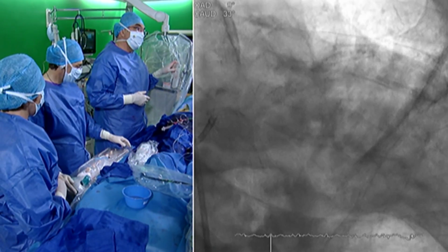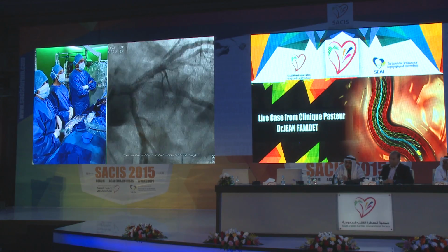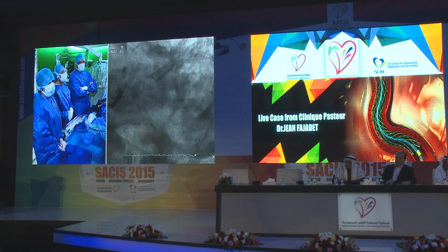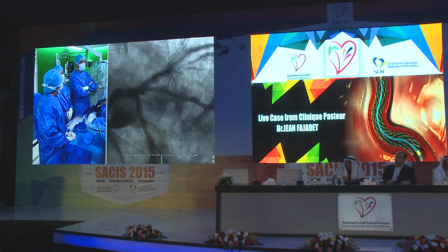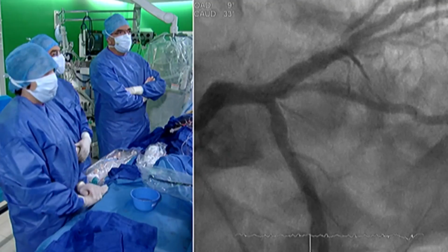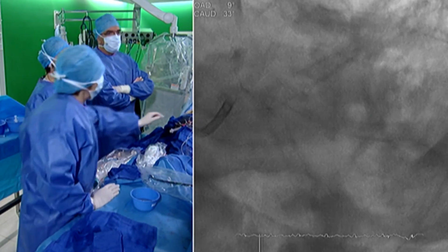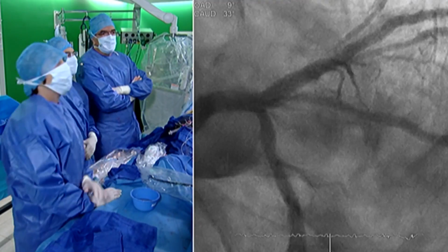Yes. We would like to thank you for taking the time, and if you can give us your closing remarks, that will be great. We saw a wonderful result, and it's the first time I've seen, personally, co-registration with the OCT, and it's wonderful. You know exactly where you are and where you have to post-dilate and fix. So please go ahead.